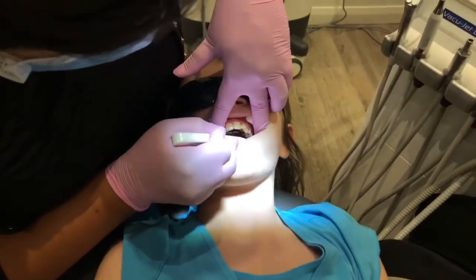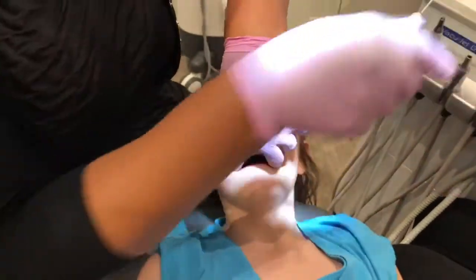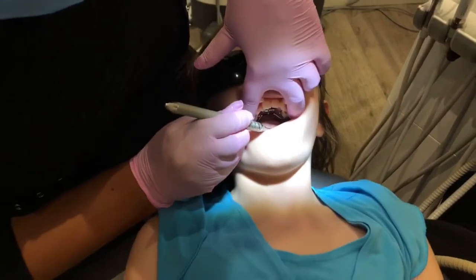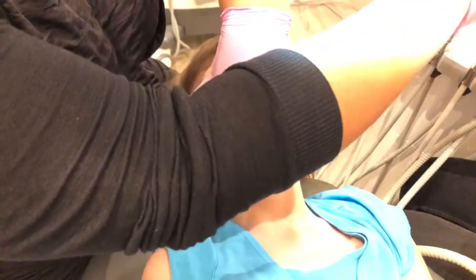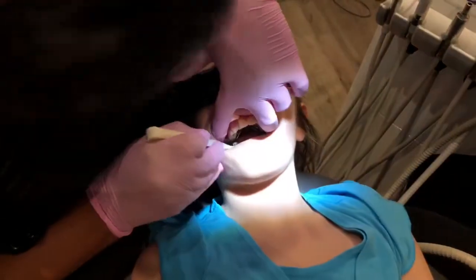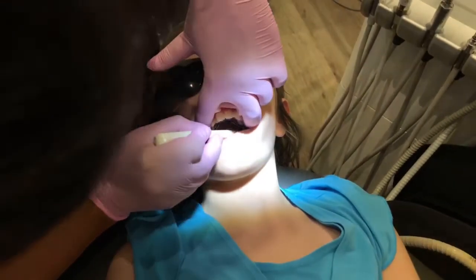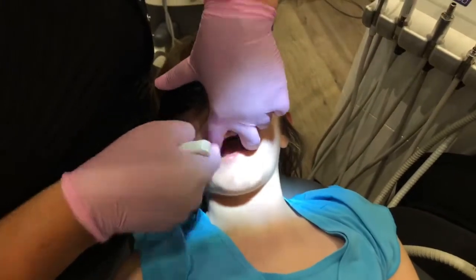Bite hard and open again. So I'm going to verify with my mirror now whether it has been placed correctly. This is a little bit okay with a tiny bit of moisture. I think I want to see the distal band. Open for me now — bite hard. So I'm trying to see the distals a bit. Bite hard. Open for me.